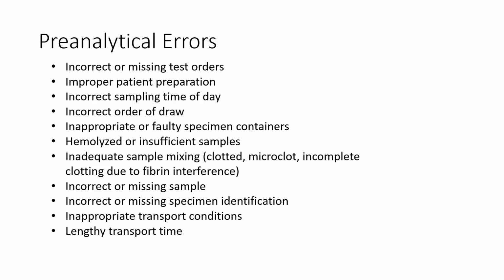Sometimes when a physician orders different blood tests, multiple labels will be printed off at once. So the phlebotomist rips off the labels, grabs some tubes, goes to the patient, and the first thing they should do is ask them to verify their name and date of birth. And then once they verify that, they're going to draw the blood, label the blood tubes after the blood draw, and then hand those tubes back to the patient and confirm, is this you?